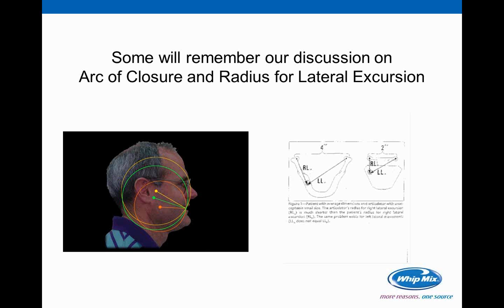When it comes to radius for lateral excursion, you can see just in the drawing here that there is a change in the way that things move when you shorten that radius. Here, this would represent a large frame style articulator, a full size articulator, and if this is the position of the tooth in relationship to the condyle, that radius would move similar to this down here.